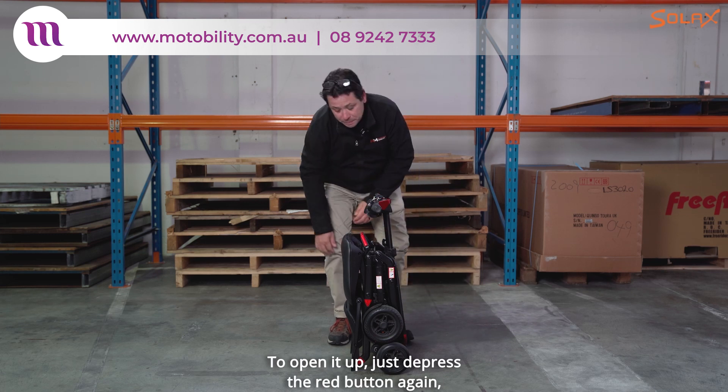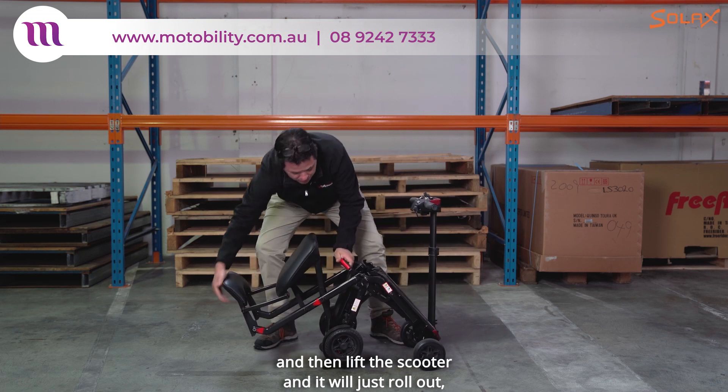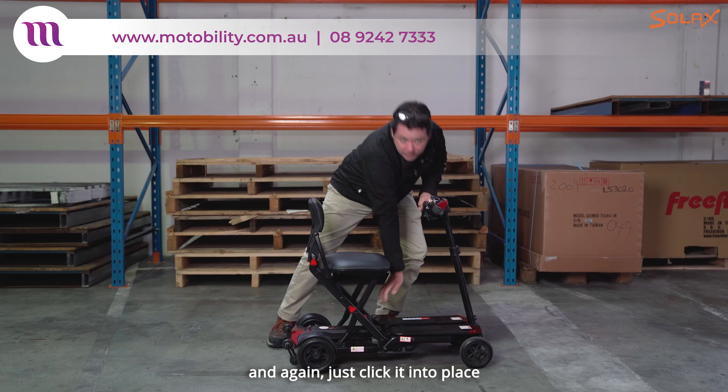To open it up just depress the red button again and then lift the scooter and it will just roll out. And again just click it into place and you're all good to go.